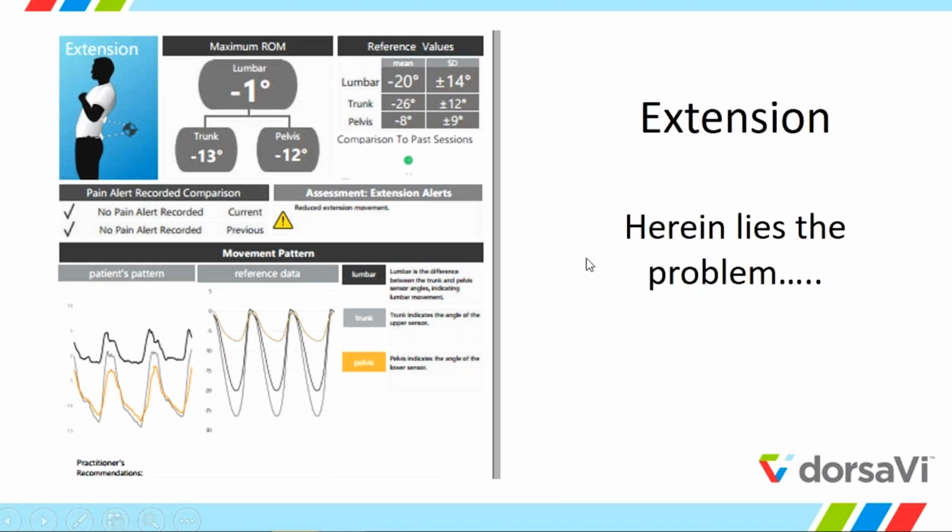So this told me, at the time he hadn't had a diagnosis yet, but I'm thinking this guy's got a spondy, because when he's loaded and standing, he won't move. And when he's sitting in flexion, we can see that he has the range in his pelvis, but he's just not doing it when he's standing, probably because of guarding, if that makes any sense. So that's just another example of how you can use this, and then test and retest. Do your intervention, and then retest and share it with the client, share it with your physician referrals.